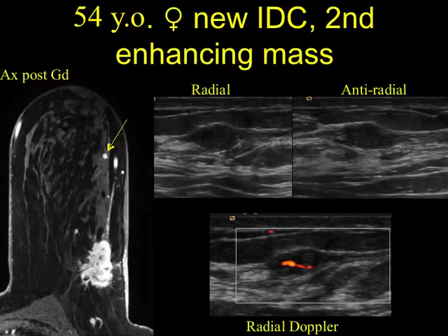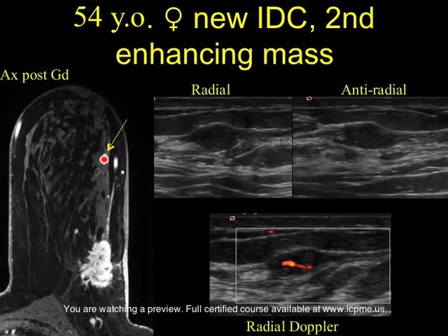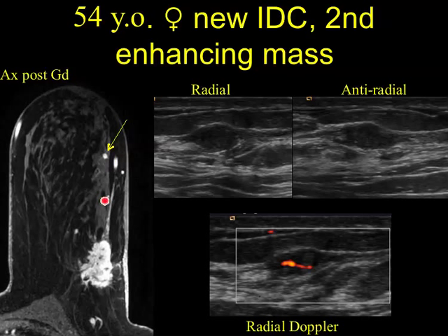Those are all good correlations. Here's another correlation with a small enhancing focus. We typically won't do second-look ultrasound for enhancing foci because the yield is low, but in this case, because of its superficial location and its relationship with a known breast cancer, we have a good idea of where to look. We find a very convincing correlate — an oval mass marginated by fat superficially and by dense tissue posteriorly — and we see vascularity within it. Not only that, but we can see a parallel vessel that we also see on MRI, using other landmarks to find the lesion in question.